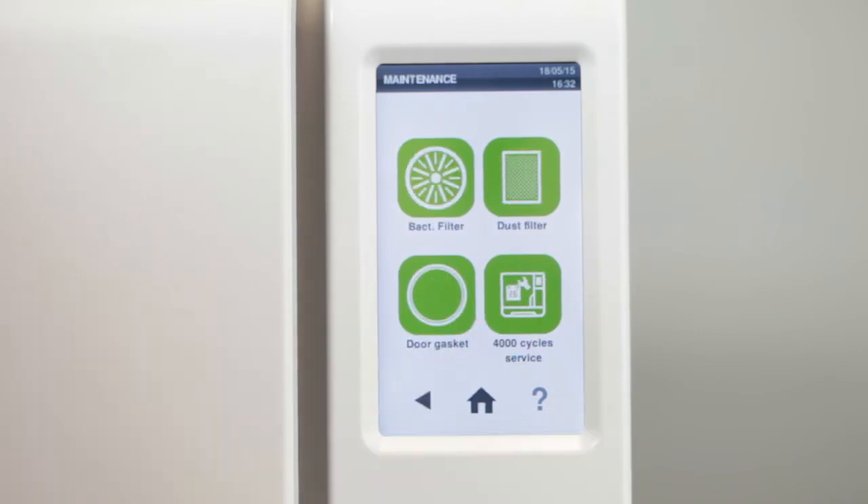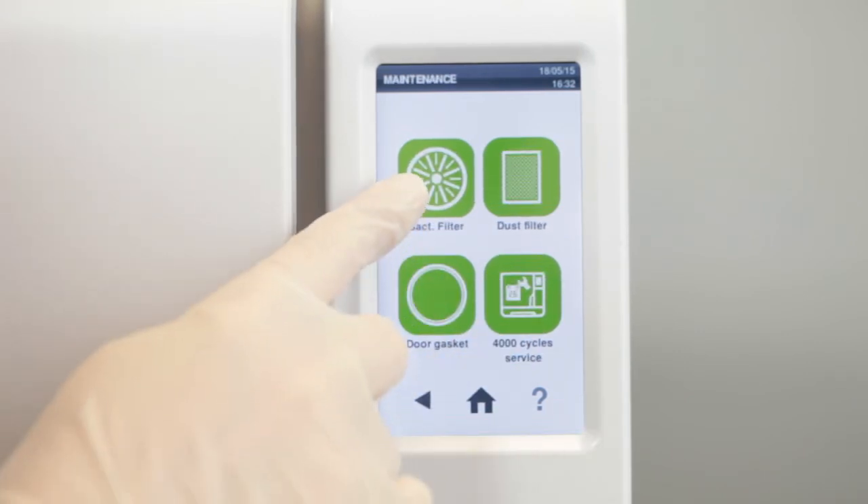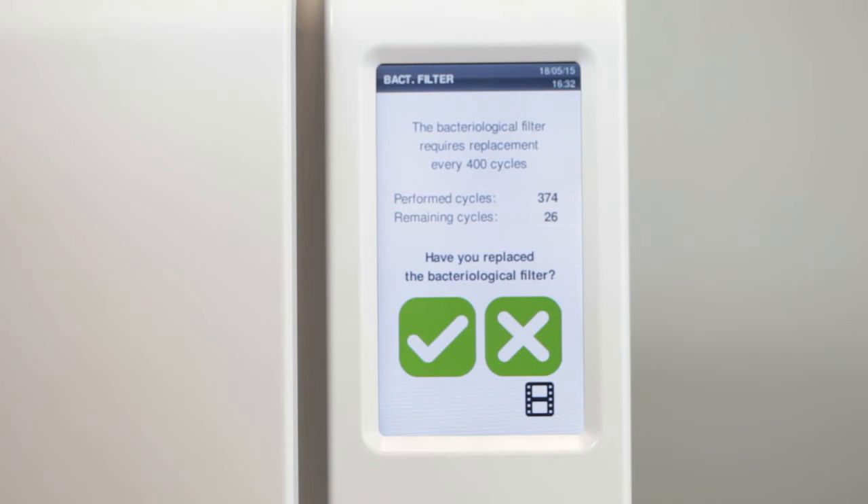Under the maintenance menu option, you also have the option to display on the screen the cycles remaining for the bacteriological filter.